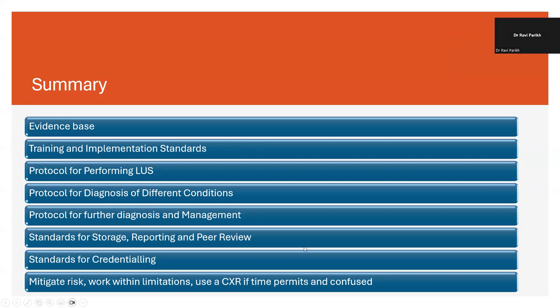I think to be safe you should scan both lungs at the same time and not just one lung. It should be a comprehensive scan. Yeah, I would agree that in the majority of cases, you should be doing comprehensive scans. I think the only exceptions that I've talked about are extremely preterm babies. I think you just have to be a little bit careful.